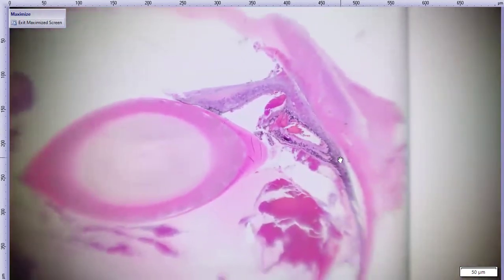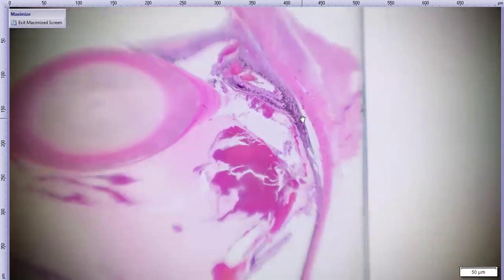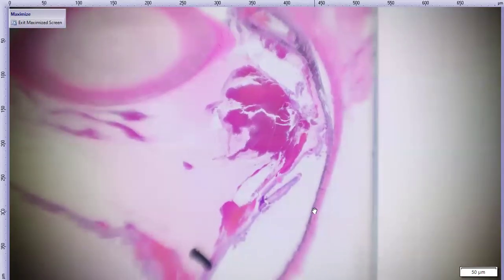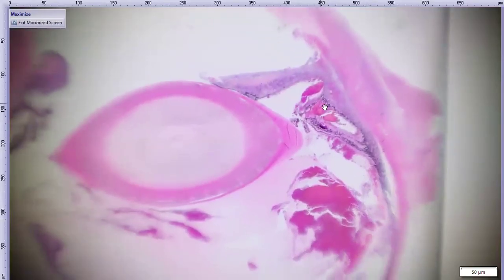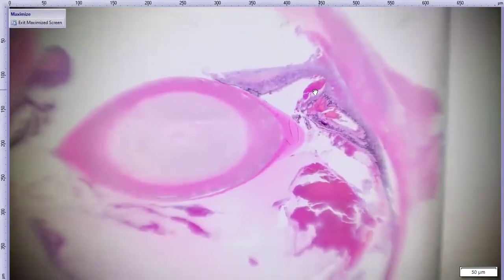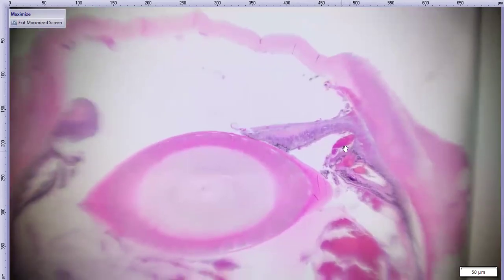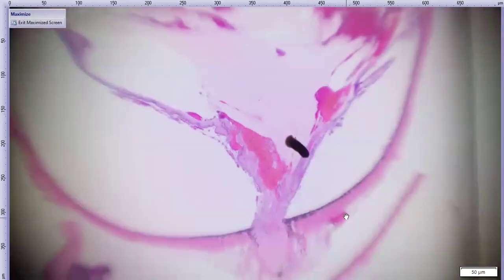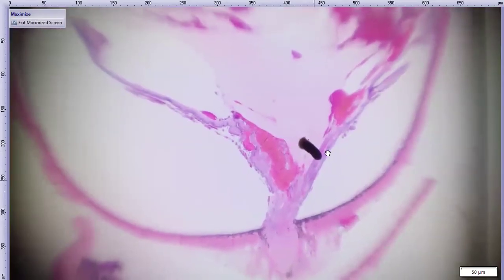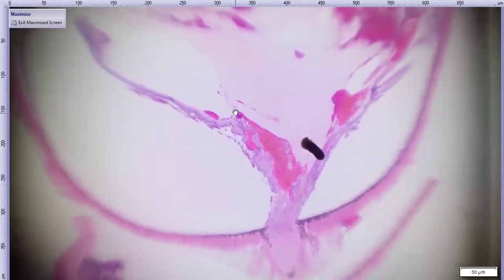That increased cellularity is also within the ciliary body. And as we move back to look at the choroid, it's a little hard to make out from here, but there's also some cells in the choroid. So there's a uveal infiltrate. As we saw grossly, there is hemorrhage within pretty much all the chambers, mostly within our vitreous here, this chamber. And then our retina is detached, as we saw grossly as well.